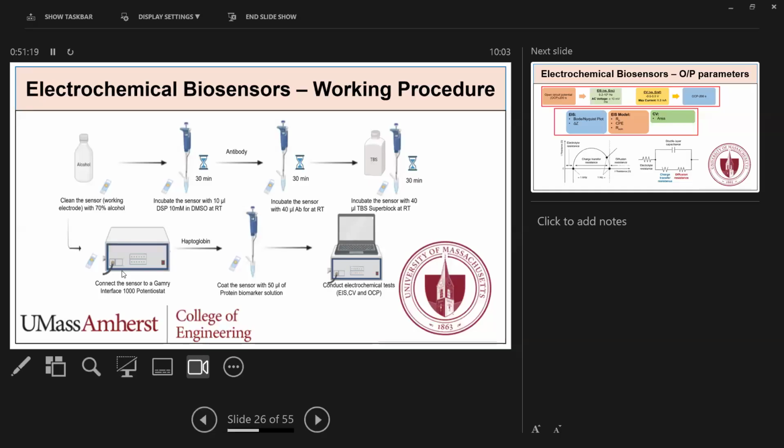And then in a series of different steps, we add a particular protein. We selected certain proteins. In this, I'm just going to give you an example of a protein which is responsible for breast cancer. We added that protein at different concentrations, because we wanted to check a concentration-dependent electrochemical sensor. At a higher level, there is a higher risk of cancer. At a lower level, it's low risk, and normal.